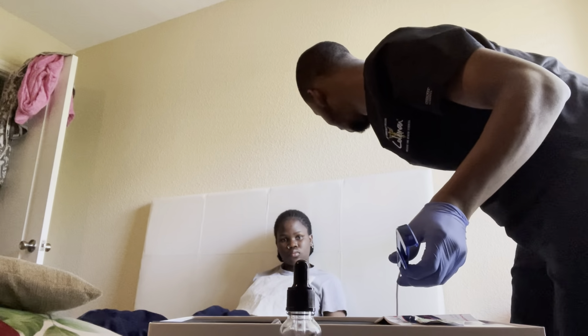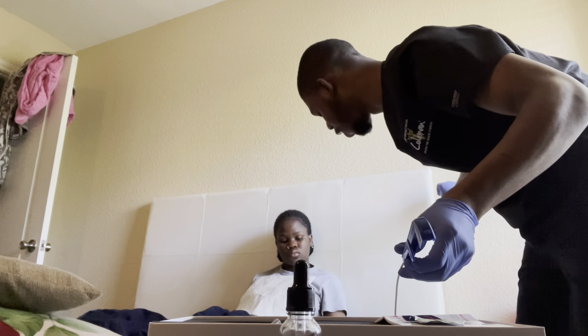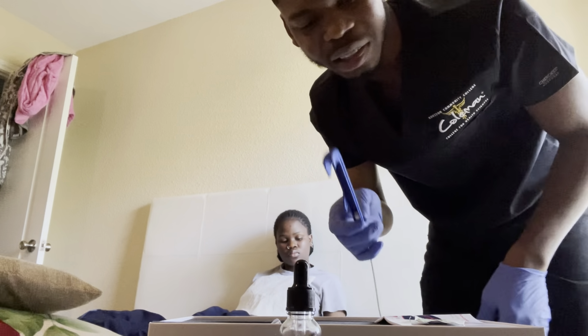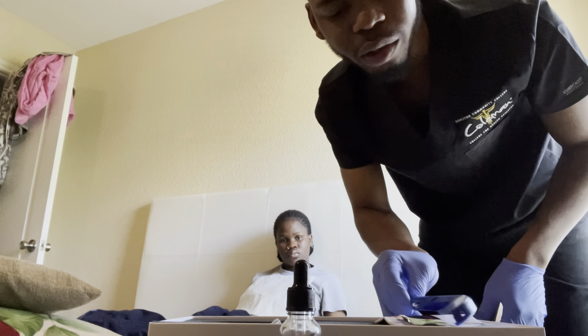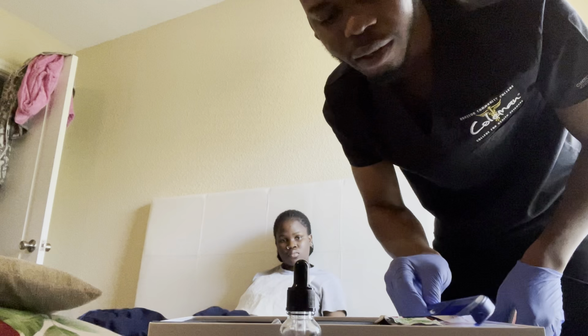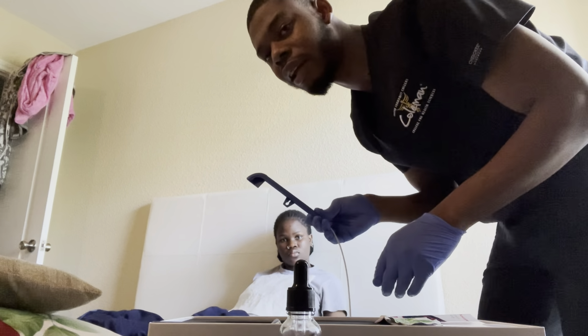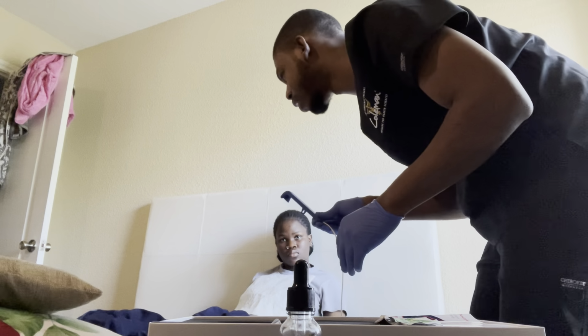I will set the suctioning machine to the lowest level. Then I will take the catheter and roll it over on the water-soluble lubricant. When I'm done with that, I will be ready to put it inside the patient's nose.